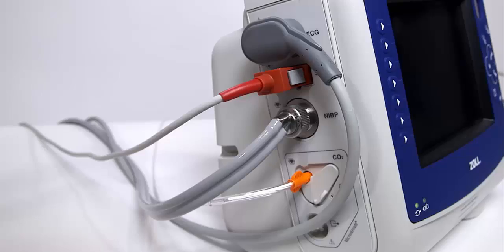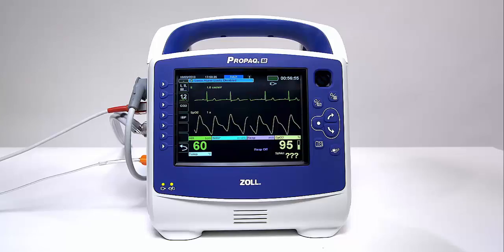Make certain the sensor cable is plugged into the SpO2 socket on the side of the PRO-PAC-M. When the connection is made between the SpO2 sensor and the unit, the message "Initializing" appears in the SpO2 display. After a brief delay, the unit displays the SpO2 measurement, shown as SpO2%.